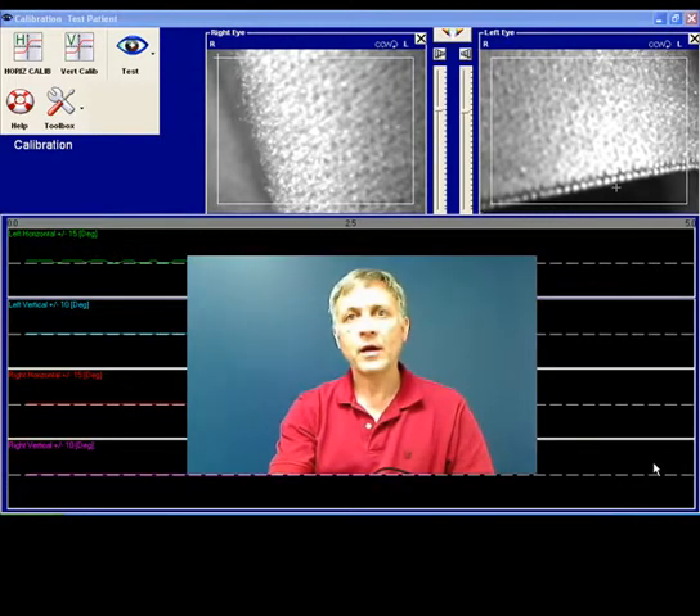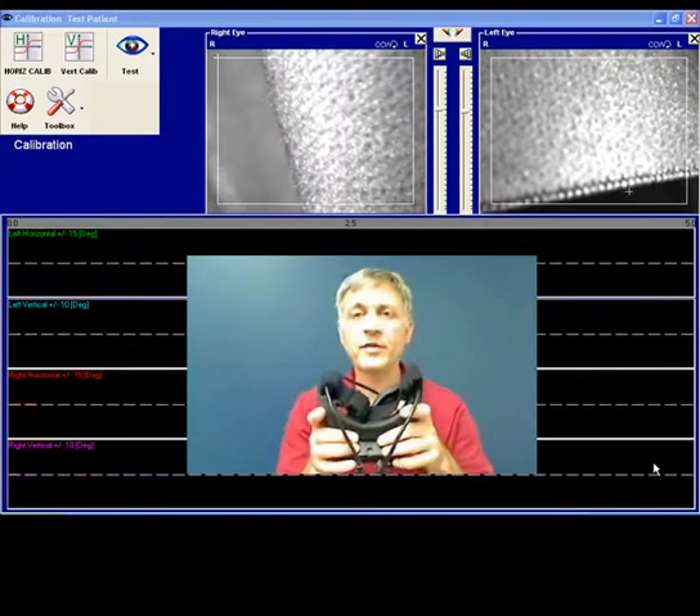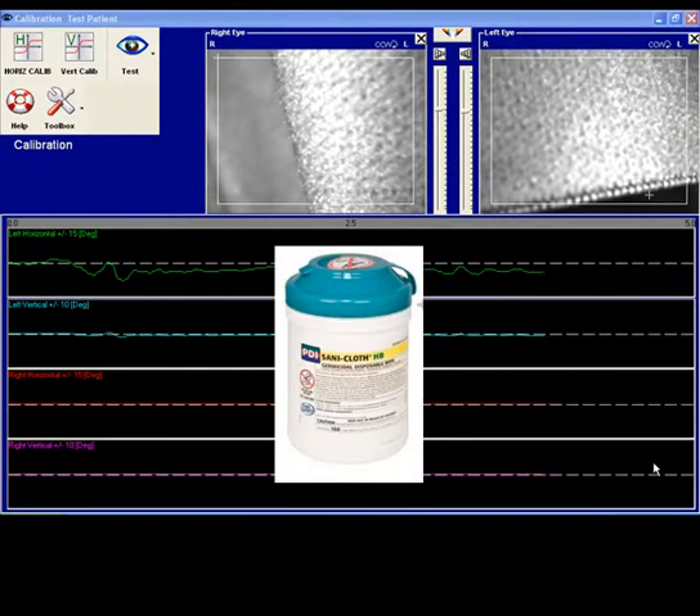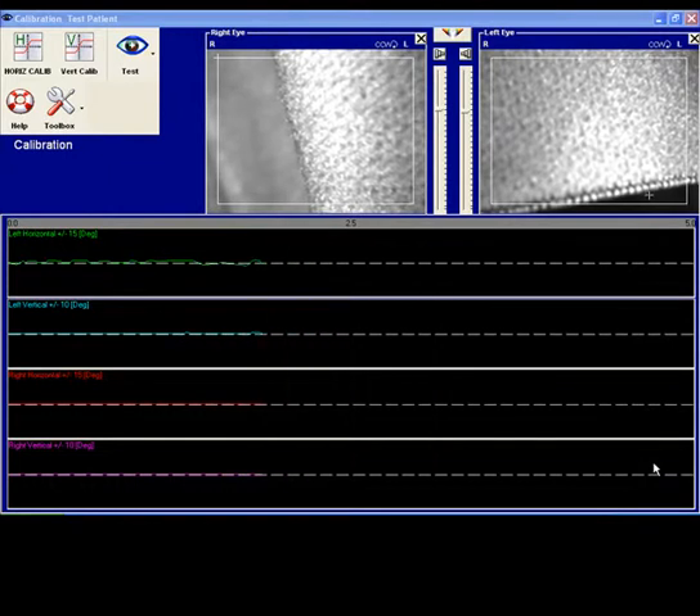We've often been asked what is a good calibration. I'd like to start off with the basics, and that is cleaning the goggles. We use a PDI Sani-Cloth HB, recommended by the manufacturers, to clean the goggles.